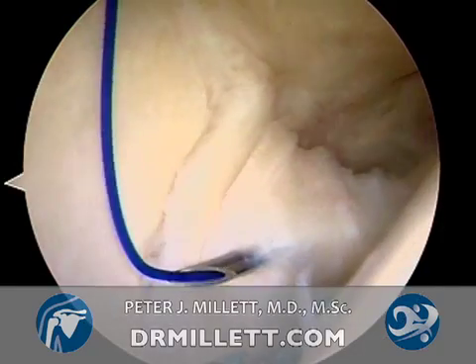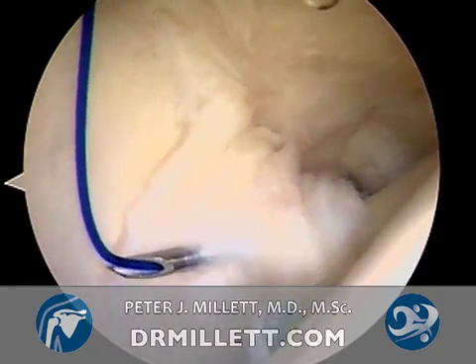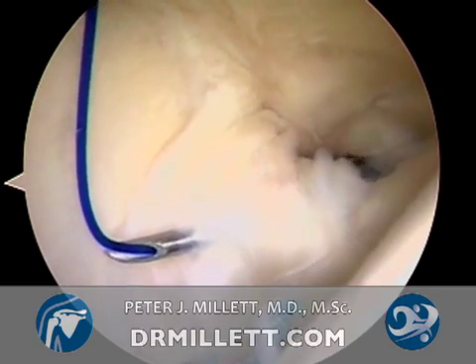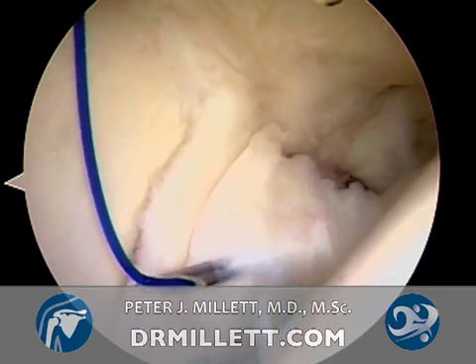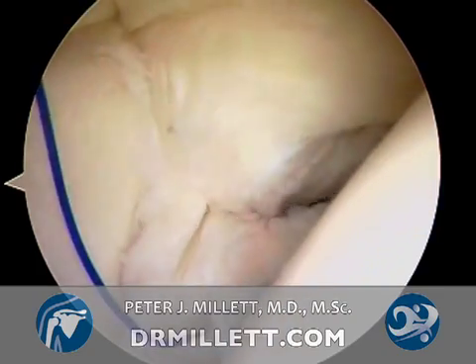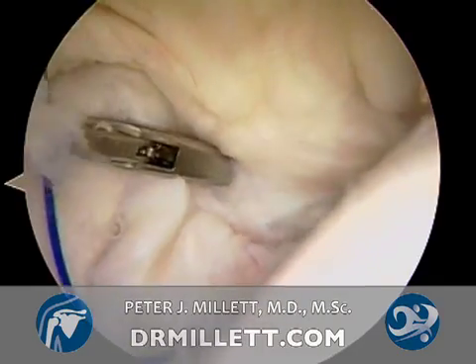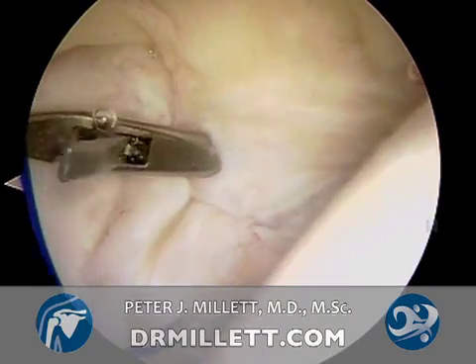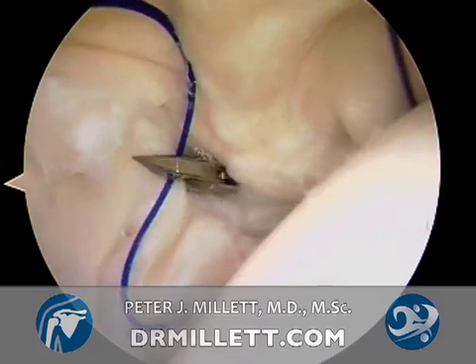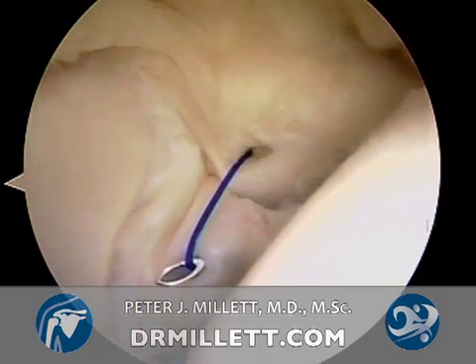A shuttling device is then passed through the cannula, penetrating the middle glenohumeral ligament just superior to the subscapularis and about 3–4 mm lateral to the glenoid as visualized here. A suture is then advanced into the joint. The cannula is redirected superiorly and a penetrating instrument is passed anterior to the supraspinatus tendon through the superior glenohumeral ligament base. The previously passed suture is then retrieved through the same cannula in the anterior portal.